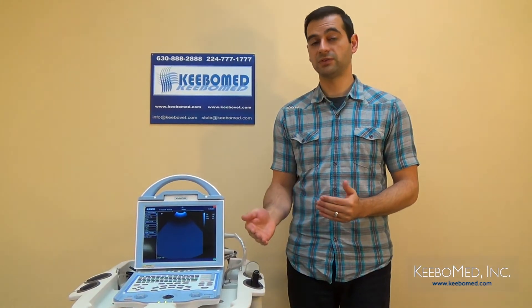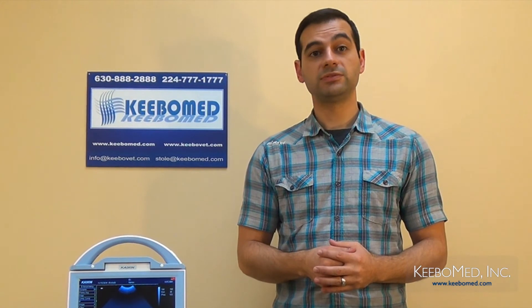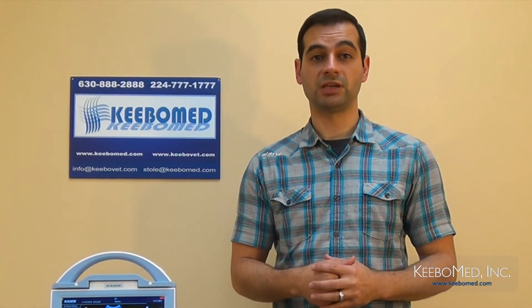So we've been able to take a quick overview of the features and advantages of the KX5600 veterinary ultrasound. This machine will truly benefit your veterinary practice because of its versatility, its mobility, and its many standard features that are not found in other ultrasounds at such a low price. Please visit our website today for more information or to purchase the KX5600 veterinary ultrasound.